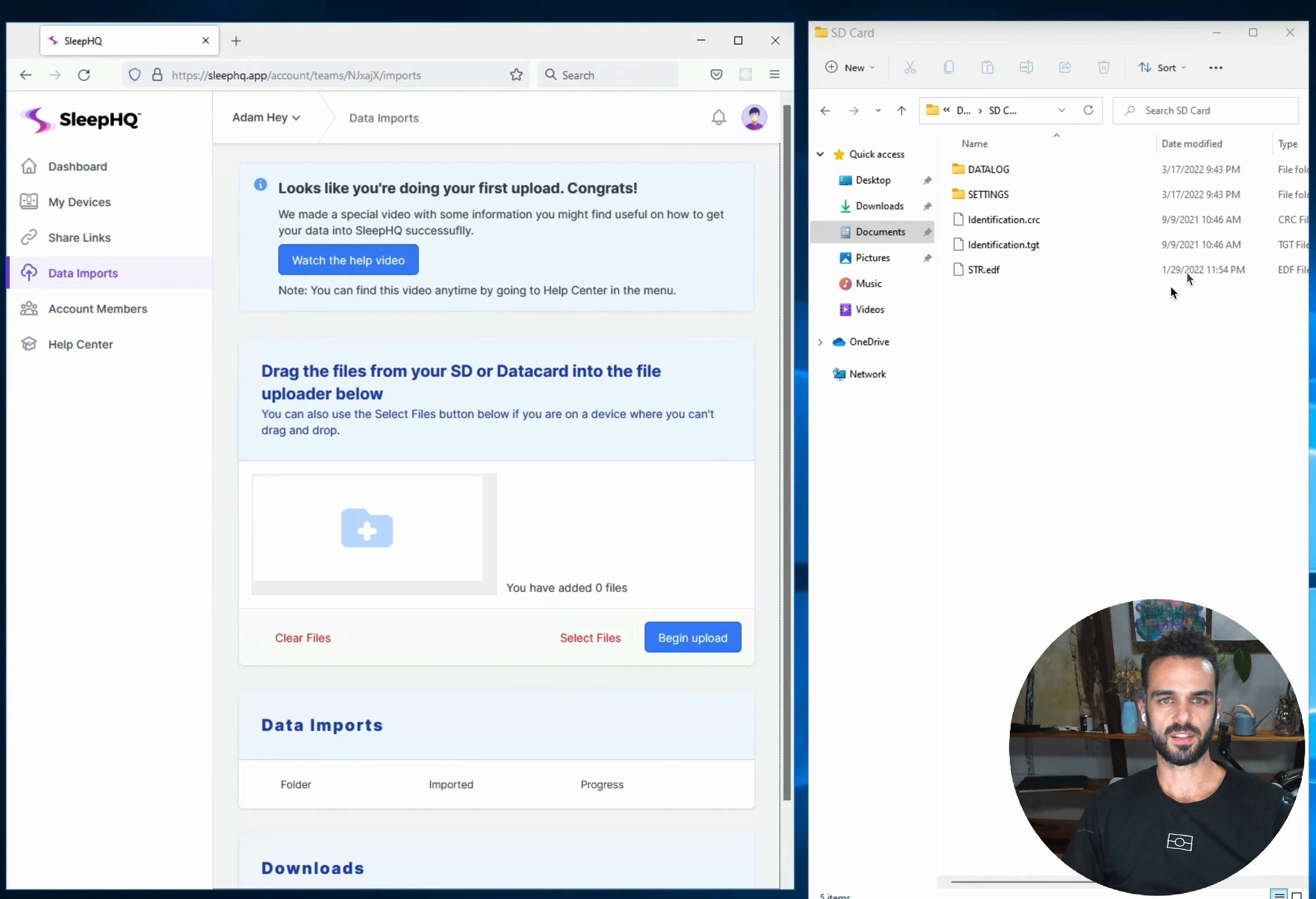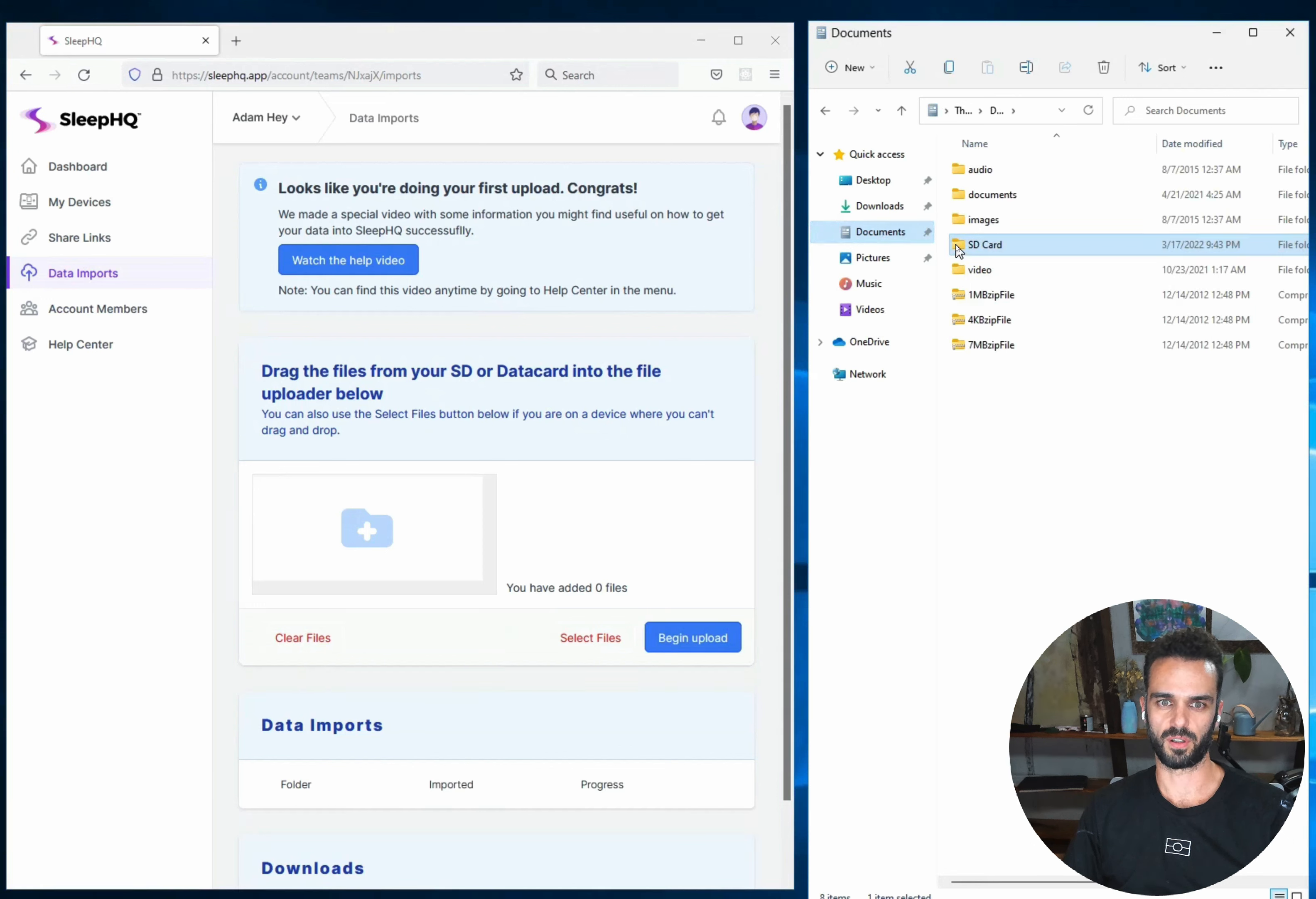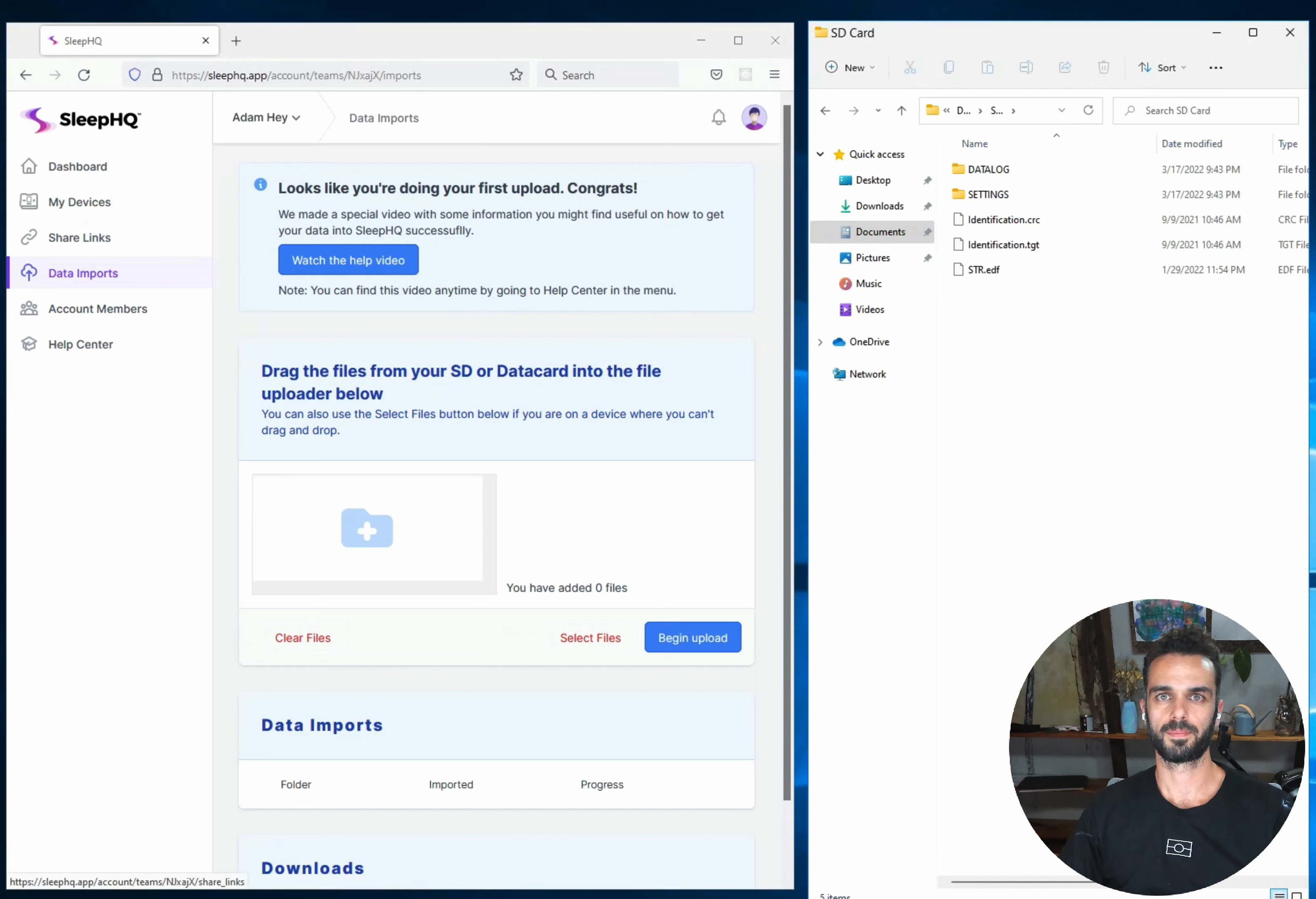On the right hand side here I've got my file explorer. So this is just a regular Windows file explorer that you would use to look around the files that are on your hard drive. When you plug your SD card in you should see it come up down the left hand side here. I'm on a virtual computer so I can't plug an SD card straight in so what I've done instead is I've just copied my SD card into the documents folder but it's going to be exactly the same. So I've got my SD card and then over in my other window I've gone to the data reports page of the Sleep HQ app.